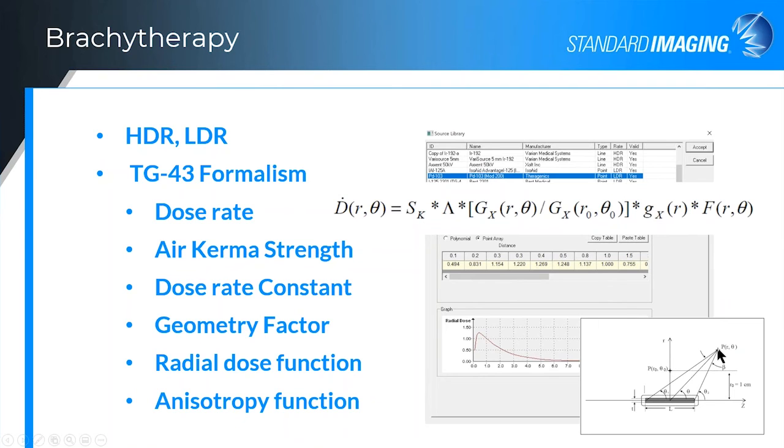And so just calculating dose to a point is the objective of the TG43 formalism.